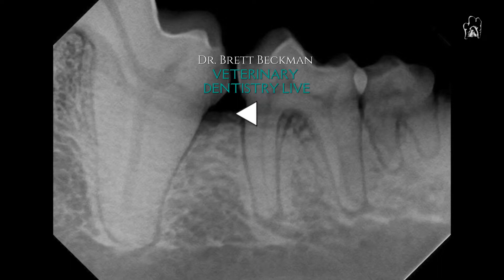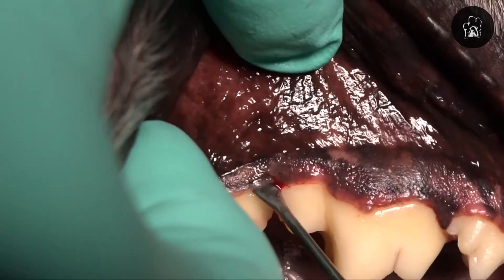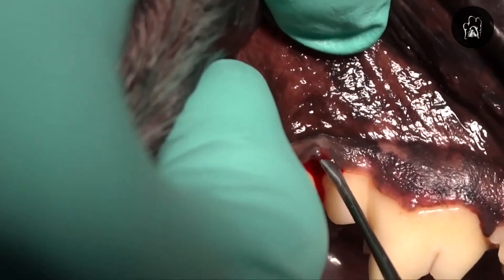However, there's granulation tissue in that defect that if left untreated or left where it wasn't removed would progress to the point where later down the road — six months to a year — that defect would become more significant. So we need to treat those. They're very common back between the first and second molar in the mandible in the dog, so we need to look carefully back there, even in young dogs.